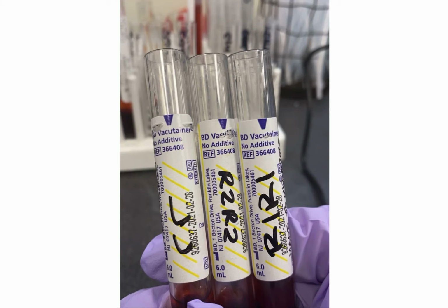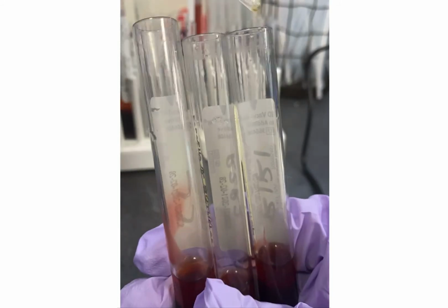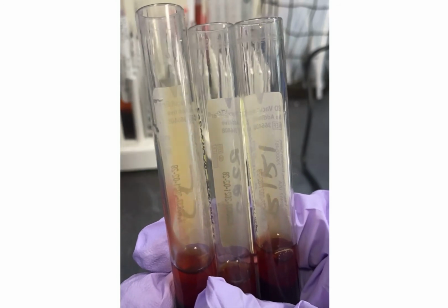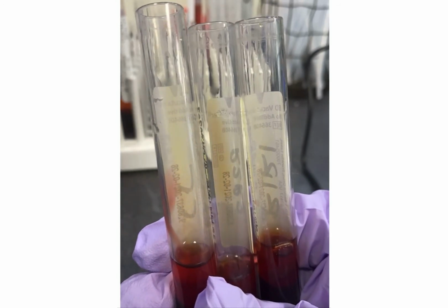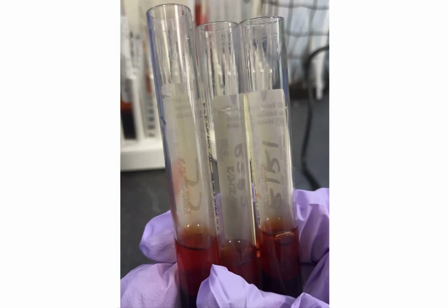Once your red cells are ready to adsorb, we will take the patient plasma and add approximately 20 drops, or equal to the volume of red cells.